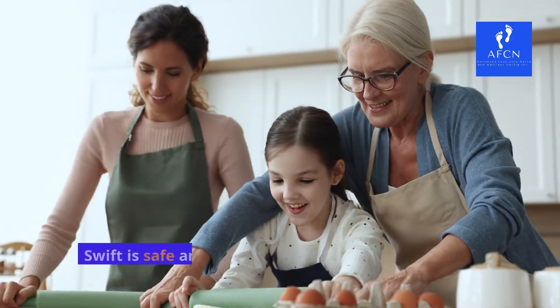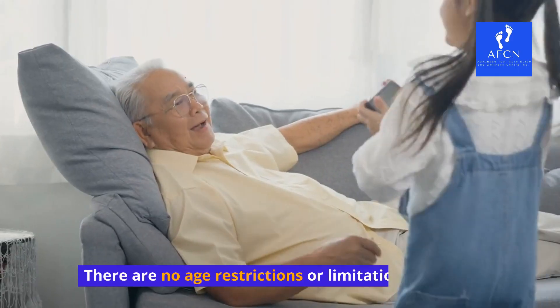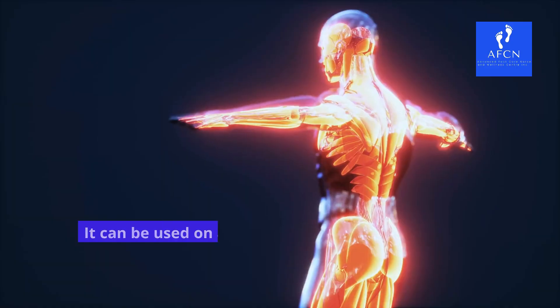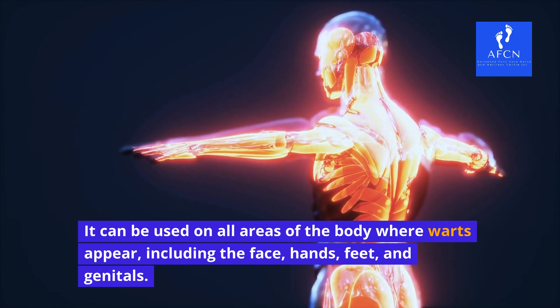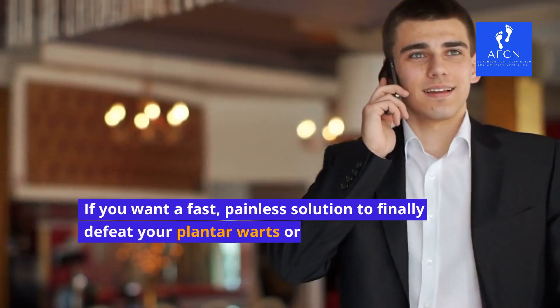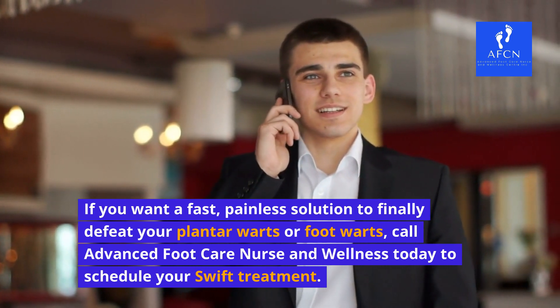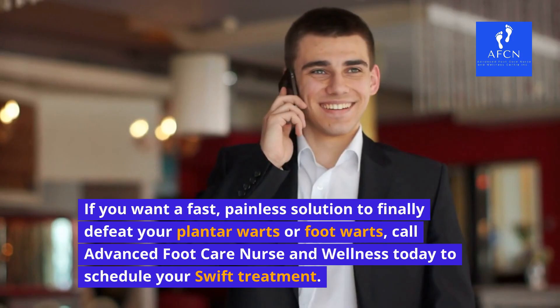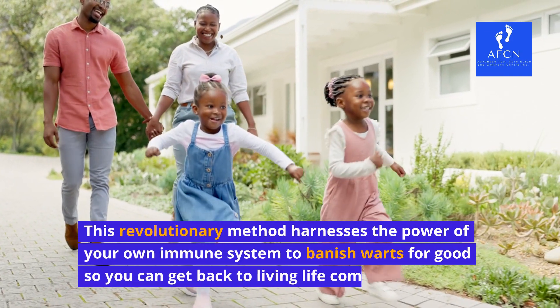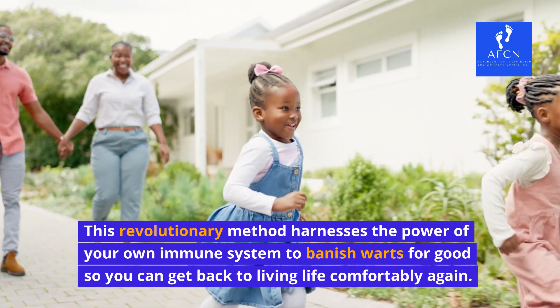Safe for all ages. Swift is safe and effective for both children and adults, with no age restrictions or limitations. It can be used on all areas of the body where warts appear, including the face, hands, feet, and genitals. If you want a fast, painless solution to finally defeat your plantar warts or foot warts, call Advanced Foot Care Nurse and Wellness today to schedule your Swift treatment. This revolutionary method harnesses the power of your own immune system to banish warts for good so you can get back to living life comfortably again.